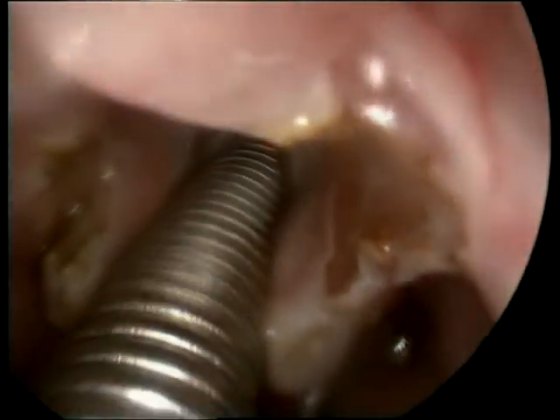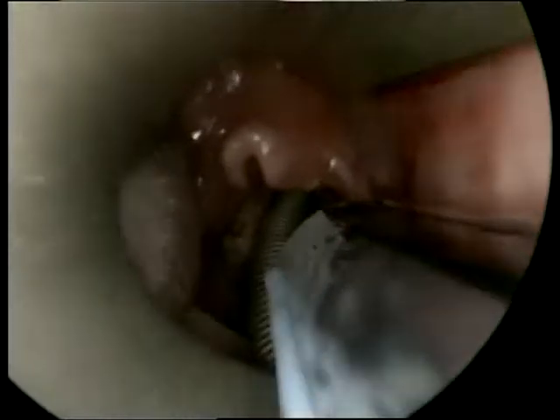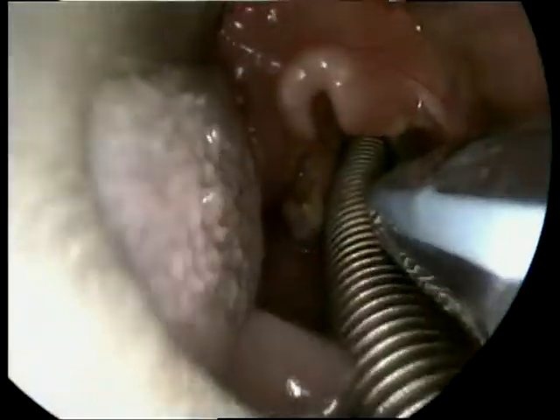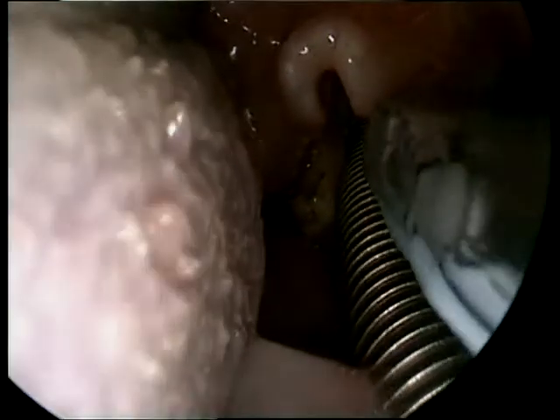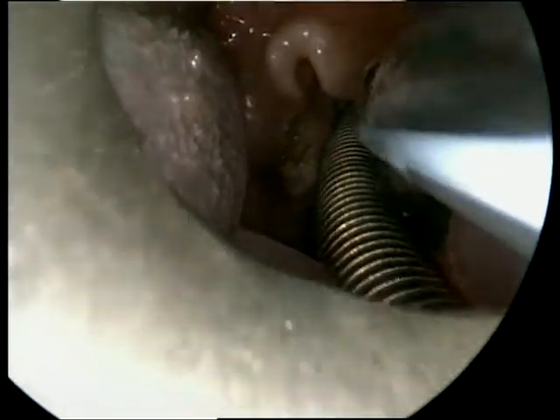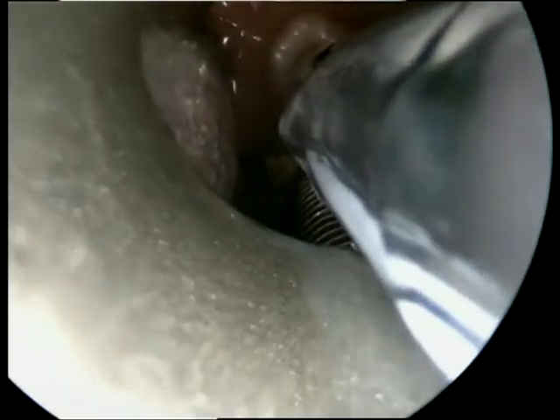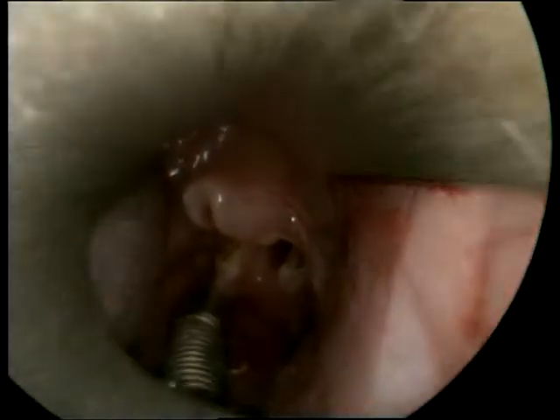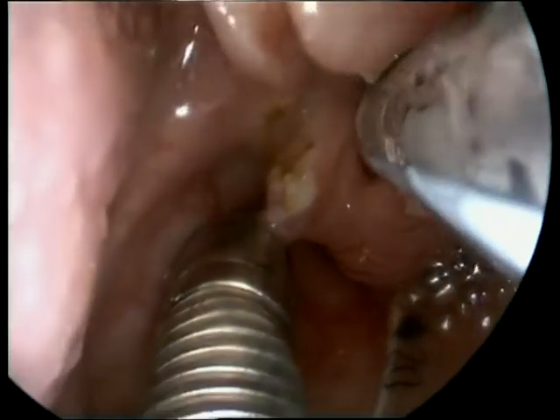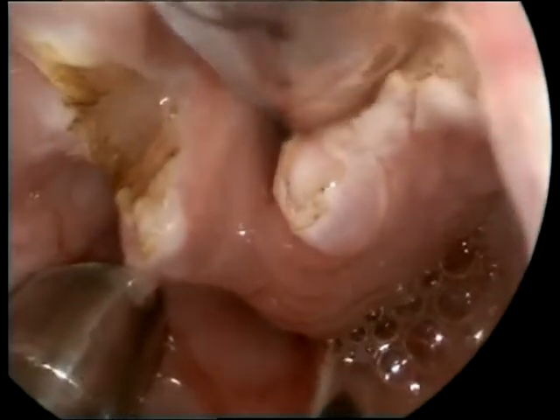An adrenaline soaked pledget is used to clean the laryngeal inlet and make sure that there is no bleeding anywhere. A regular endotracheal tube is placed at the laryngeal inlet to measure the size and make sure we're using the correct size — a cuffless tube would do. The anesthetist is requested to pull out the laser-specific tube so we replace it with an endotracheal tube which is less traumatic. The anesthesia team did a great job maintaining the child's oxygen saturation at nearly 100% while administering the lowest amount of oxygen to avoid the chances of combustion.